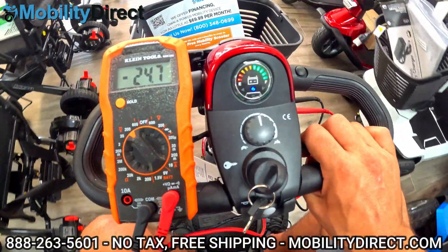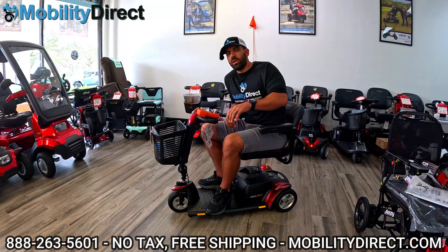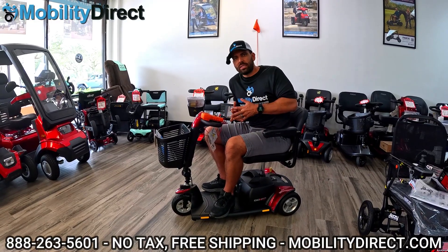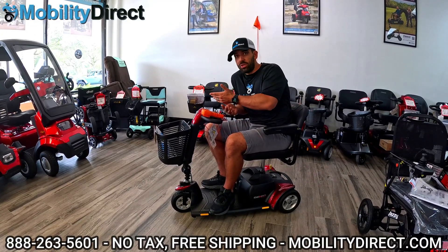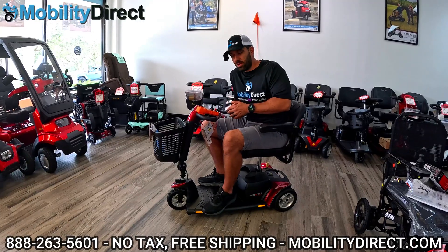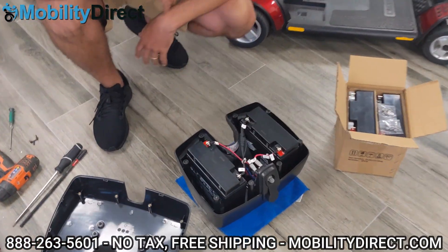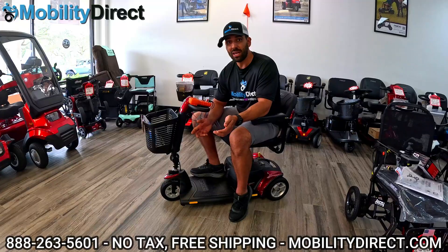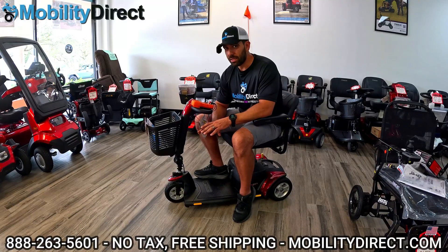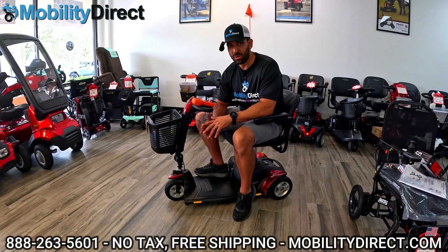Now let's say you're doing this load test and getting a different readout. If at a standstill your batteries are showing 25 volts and once you start the load test it drops down to 23.5 or below 24, that could mean your batteries need to be replaced sooner than later. If you notice that on a short distance ride your batteries die rapidly, that definitely means you need to replace them soon. You could also open up your battery box, expose the batteries, and check the terminals for any corrosion, rust, and oxidation — that can lead to poor battery performance. You want to keep your battery box completely dry and avoid going in really moist or humid areas, because batteries just don't like water or moisture.